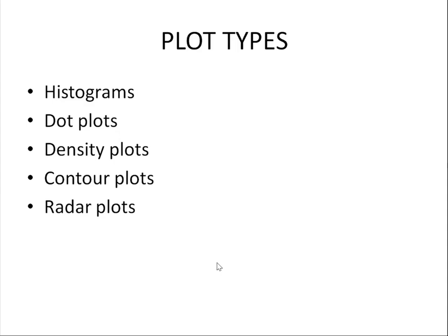If you see a DXH dot plot, you will have volume on one side and scatter on the other side. That is called VCS technology. So a dot plot is the one which has parameters on all its axes, both x-axis and y-axis, and if it's a three-dimensional dot plot, you have one more parameter on the z-axis. Whereas a histogram always has only one parameter on the x-axis and the y-axis by default is count. That is the difference between a histogram and a dot plot.